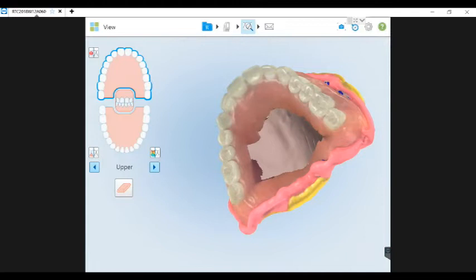laboratory and just call the lab and say, hey, I'm going to be doing a scan. I should be finished up around 1:30 today, and I'd like you to be able to take a look at it before I dismiss my patient. Can we coordinate that? I think that is very doable, but just to call and hope that the person or people that are the experts in evaluating your scan are available at that moment, I'd hate to put you under that pressure, or the patient under those kind of timelines for dismissal.